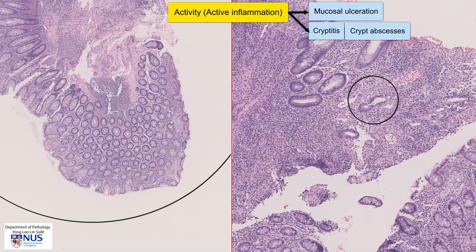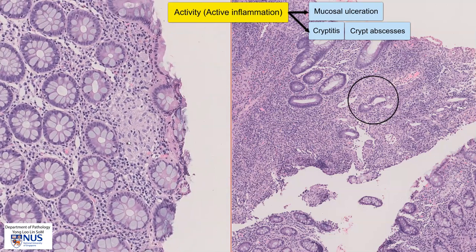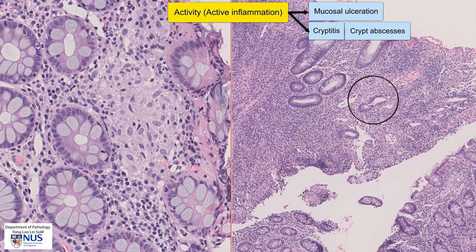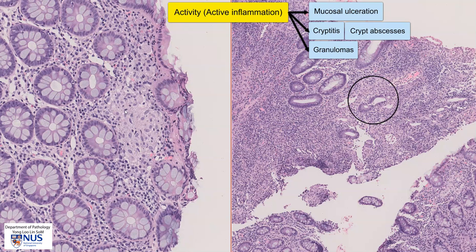Yet another feature of active inflammation is seen on the left picture. Here we can see a slightly pale aggregate of cells, and on higher magnification we can see that this is actually an epithelioid granuloma, where we can see epithelioid histiocytes with elongated slender nuclei and fairly abundant pale eosinophilic cytoplasm. The presence of granulomas not in association with damaged crypts is suggestive of Crohn's disease. Of course, we would also have to exclude infectious colitis, for example TB colitis or TB ileitis.